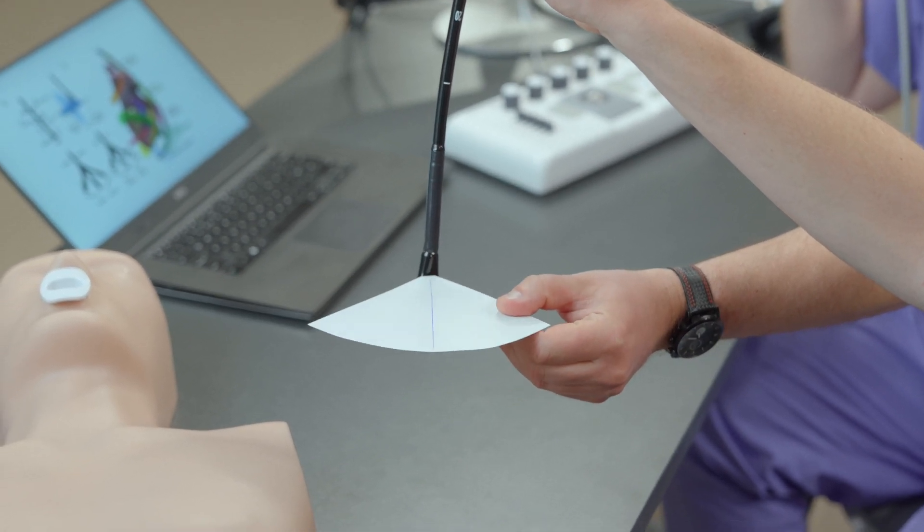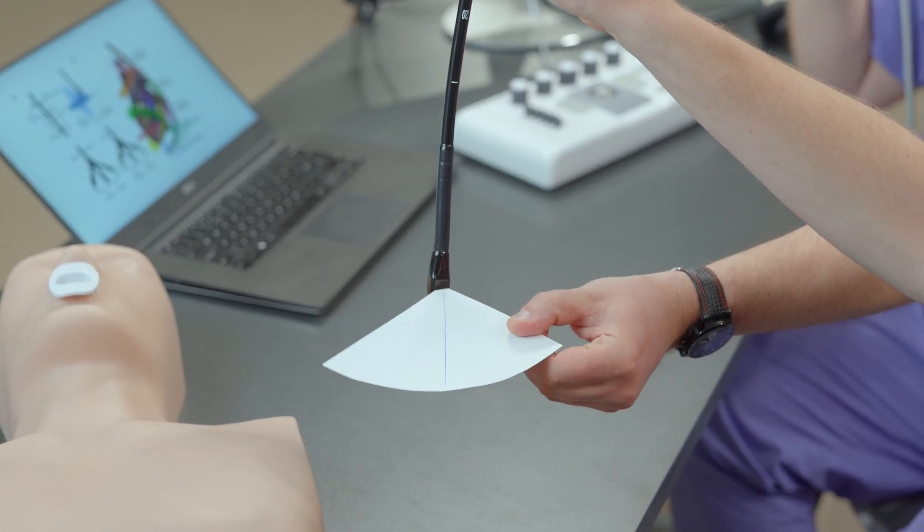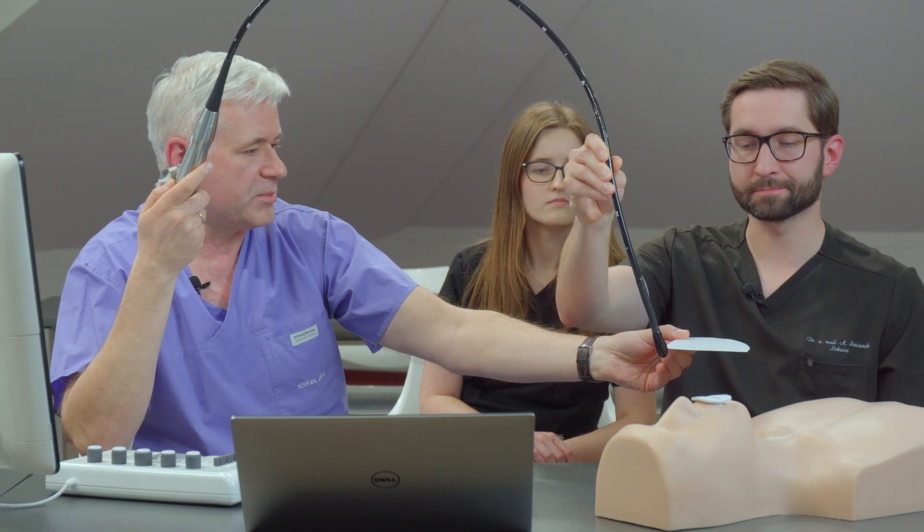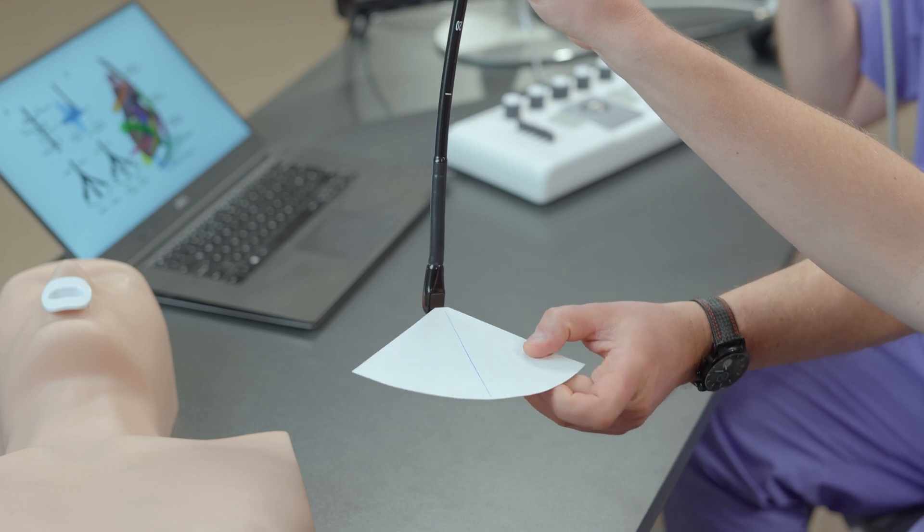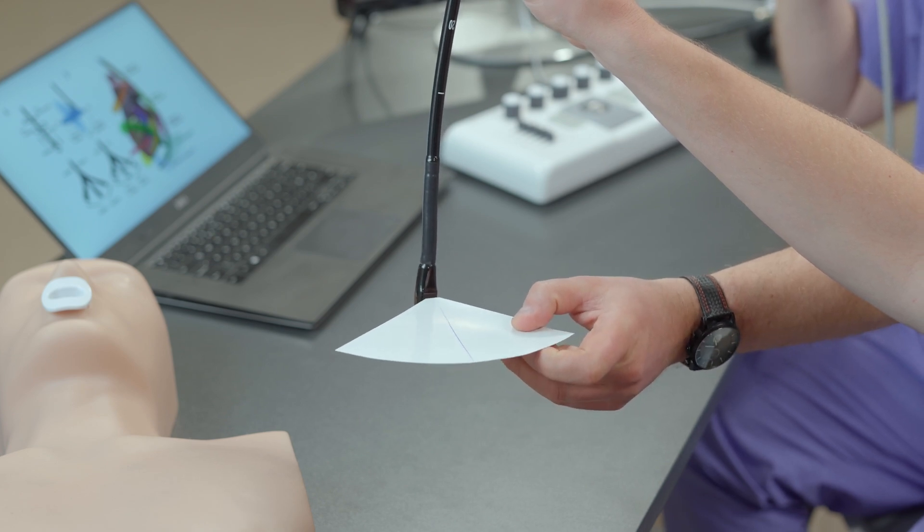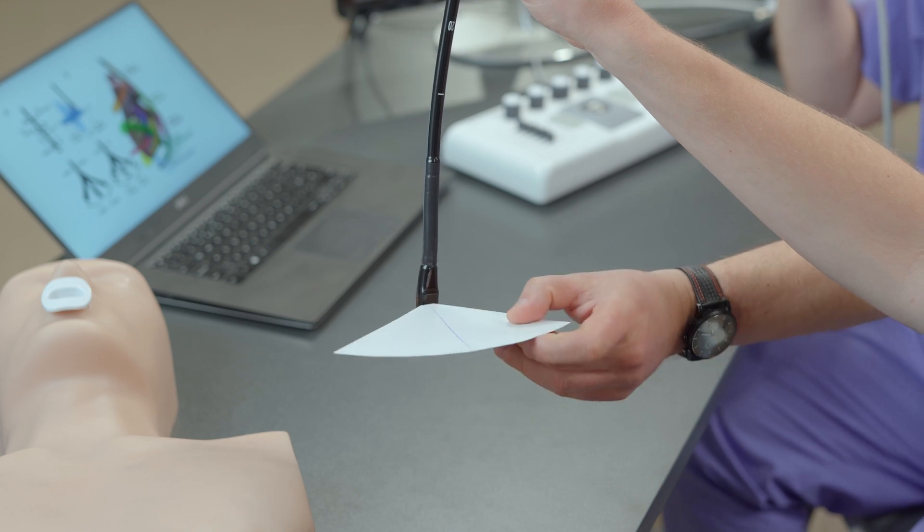This is the representation of the plane that you're going to use during the examination. This is what we call the zero degree view, where the plane is perpendicular to the long axis of the esophagus.